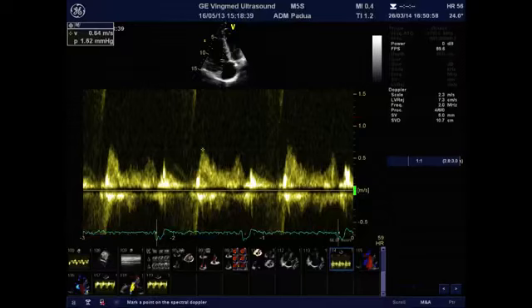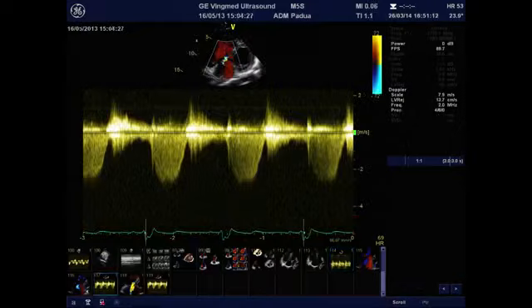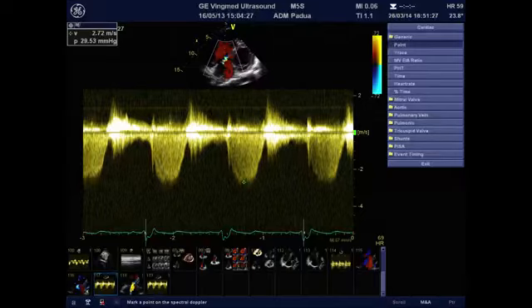And finally, as I said in the beginning, we should always assess also the pulmonary pressures. The pulmonary pressure with a continuous wave Doppler across the regurgitation. Here, if you would measure the maximal velocity, it is 29-30 millimeters of mercury, to which we need to add also the pressure estimated in the right atrium.